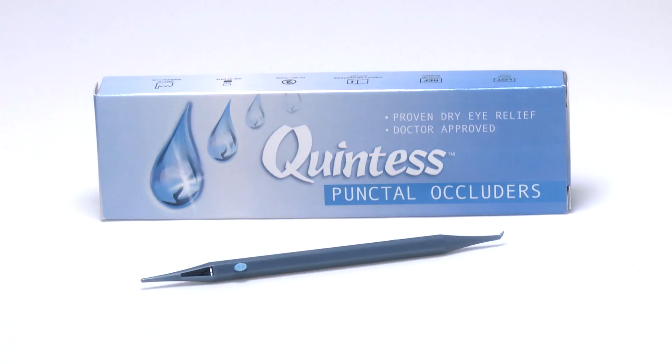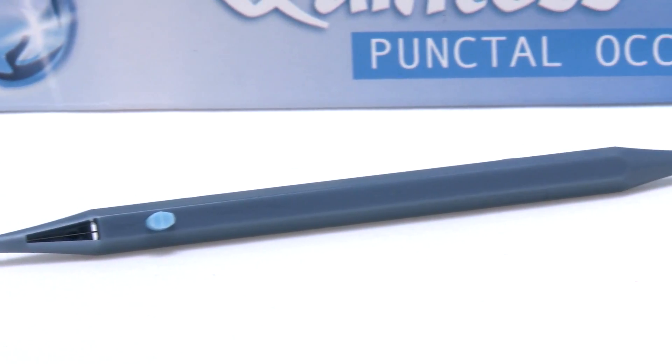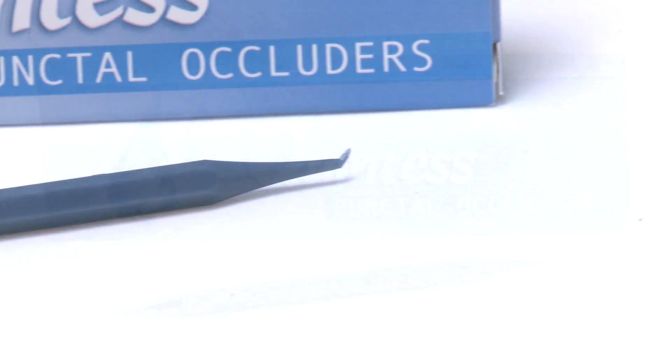Quintess Punctal Plugs' unique patented tear pool design reduces foreign body sensation while ensuring optimum performance. They now include new and improved insertion instruments with a color-coded punctal sizing guide, making it easier than ever to determine the correct punctal size.